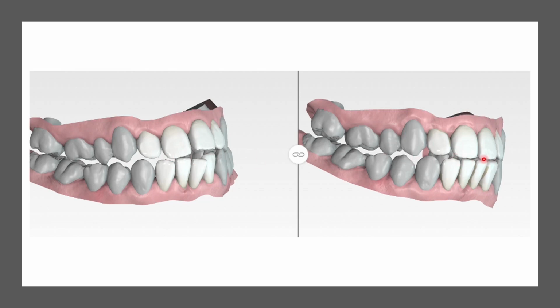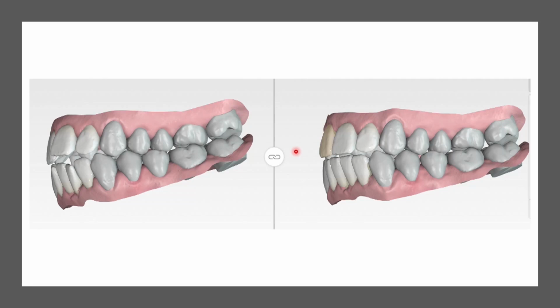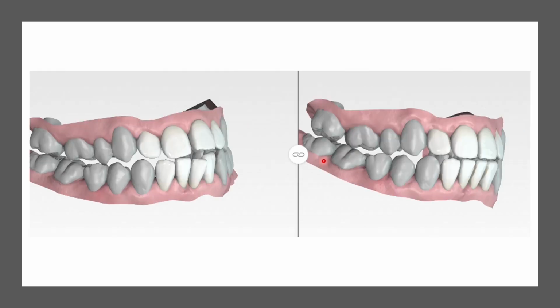The design actually was, we were not able to get on the design a full closure of the open bite. We can still see that there. And so from a consent perspective, that needs to be flagged up. So when we see things that might not give us full closure on that open bite, we did flag that up at the consent and said, look, we can do some relatively straightforward moves here, but you're probably not going to get things fully together at the front there. The patient was very accepting of that. So we're aiming for an improvement here using some simple aligner moves.